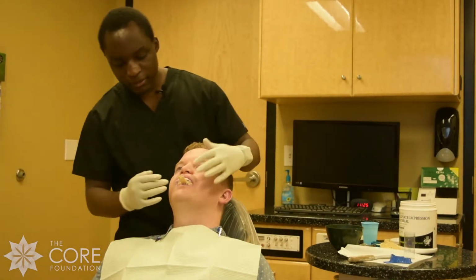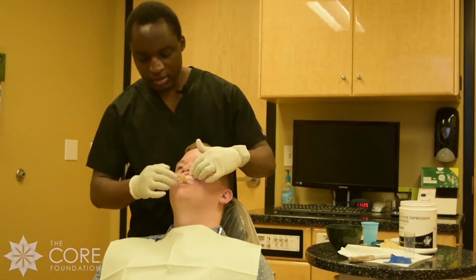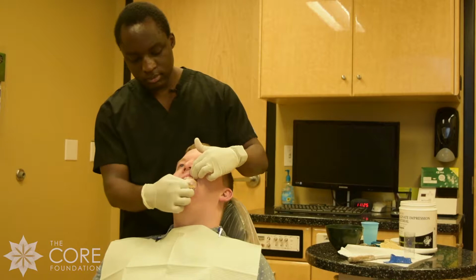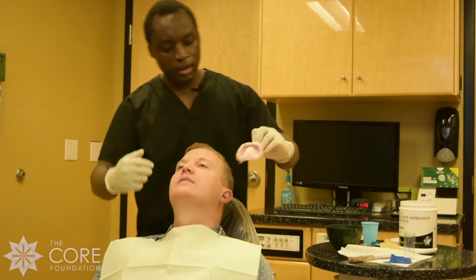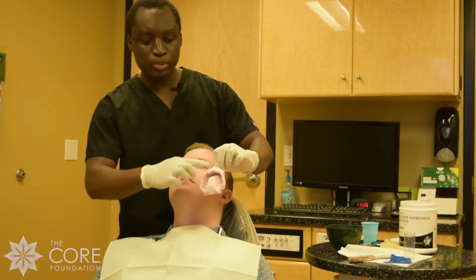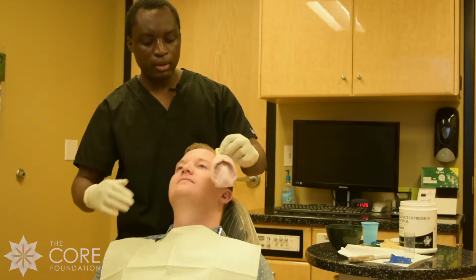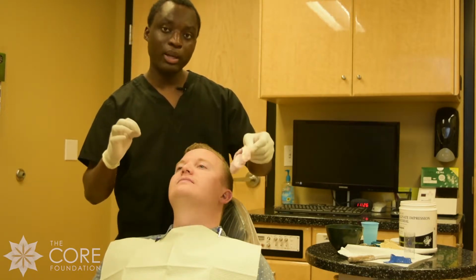Okay, so it's been about 45 seconds, and as I am checking this, I notice it is really hard and set. So go ahead and open. All right, and then you slowly pull. And when you look in here, you'll notice I have all his teeth really nice. I have a nice firm ridge over. So when you make the impression, it can go all around it really well, and there are no spaces missing. So this is a really great impression.